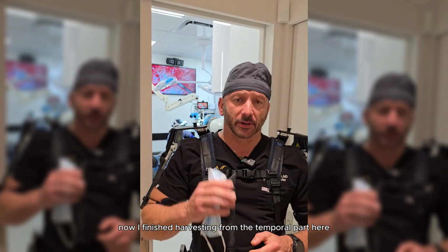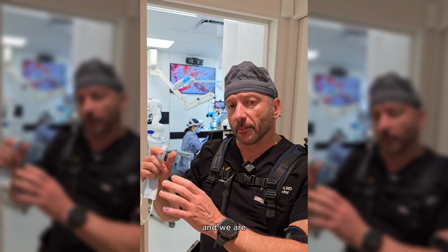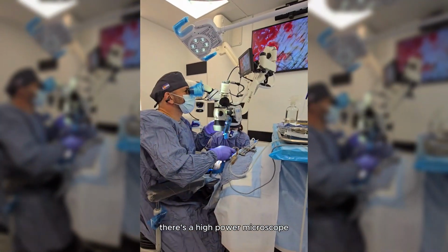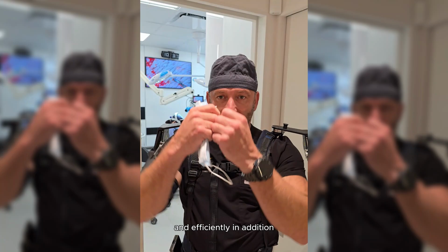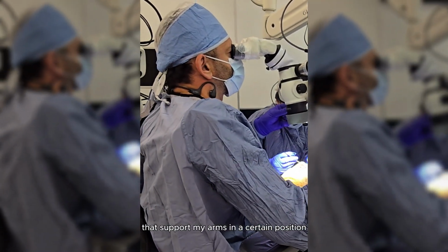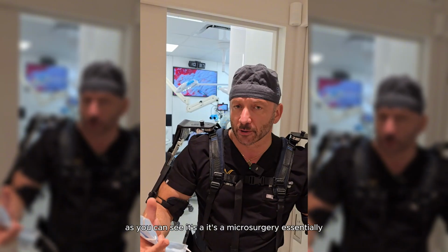Now I finished harvesting from the temporal part here, and we are finishing the last stage of collecting these grafts, and then I will work on the occipital part. As you can see in the back, there is a high power microscope. It's wall mounted. It allows me to work very ergonomically and efficiently. In addition, I use this exoskeleton that supports my arms in a certain position, so I don't have to frequently readjust myself. As you can see, it's essentially microsurgery.